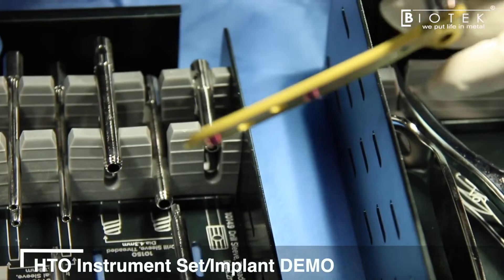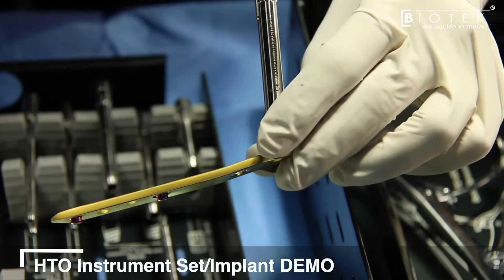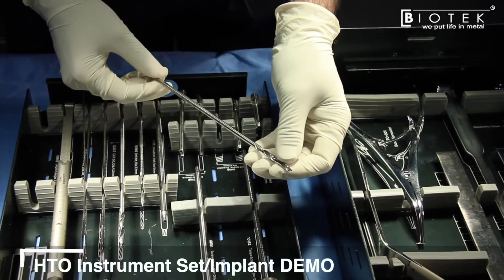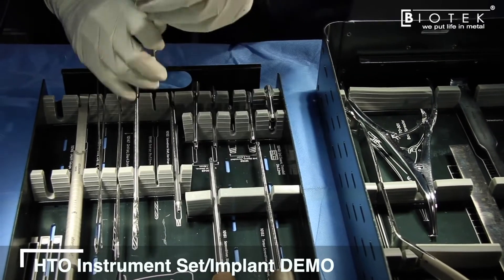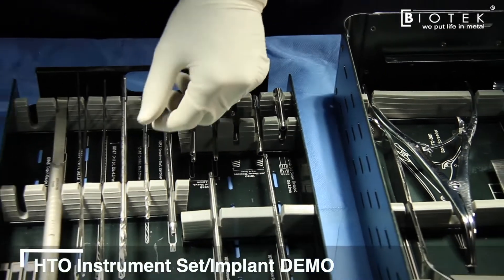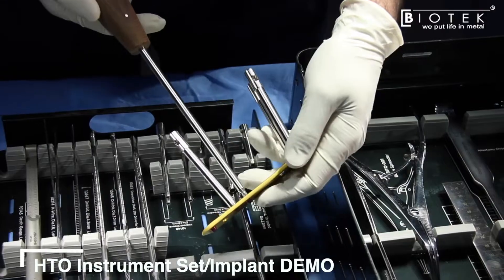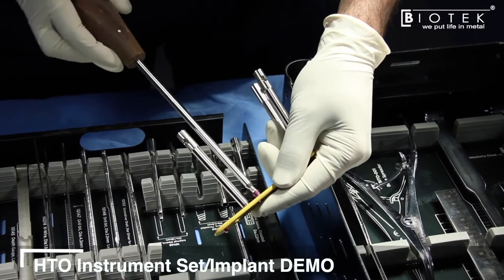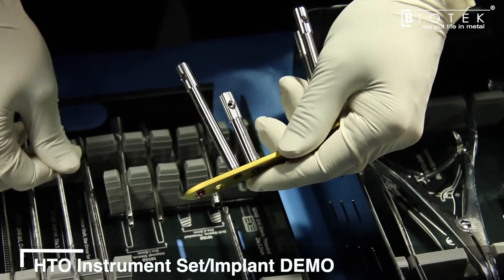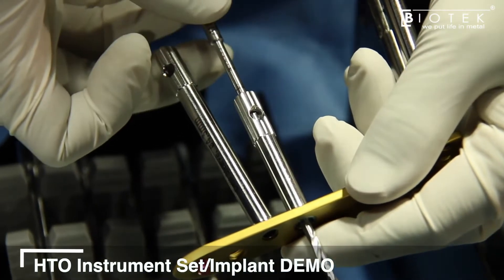Once the plate is positioned over the periosteum, fixation can be performed in any sequence. A 4.3 mm drill bit is provided for locking screws, and a 3.2 mm drill bit for the non-locking screw. For hole number one, if a non-locking hinge compression screw is desired, use the 3.2 mm drill bit after removing the spacer. Drill bits come with laser markings so screw depth can be read directly during drilling.